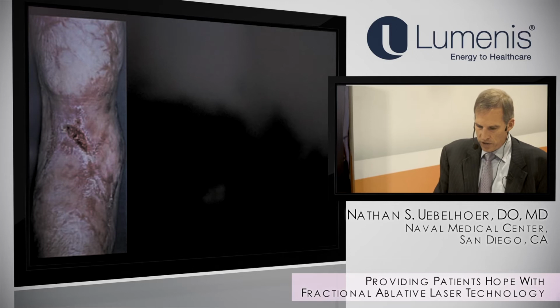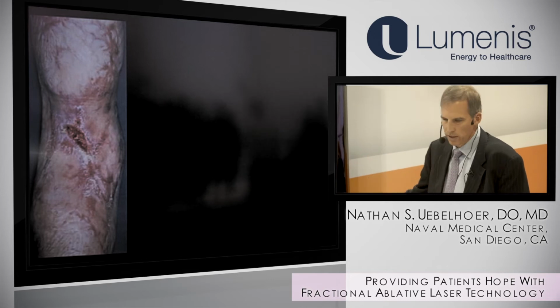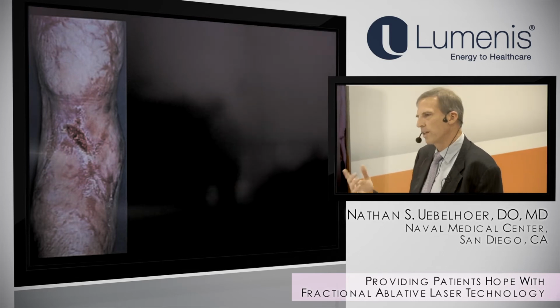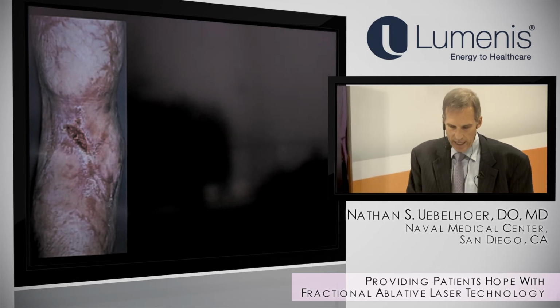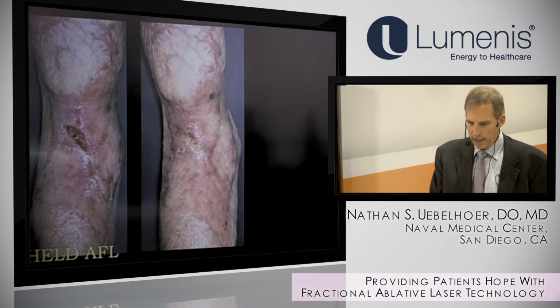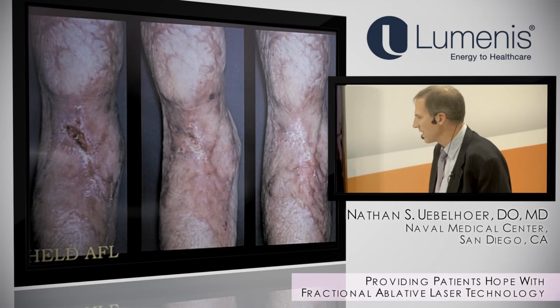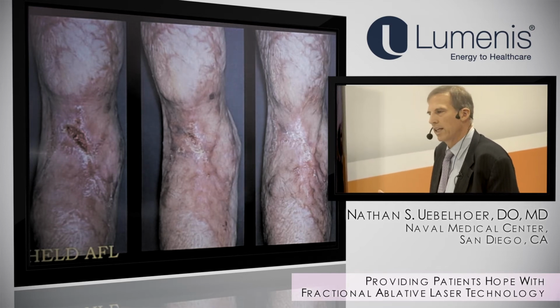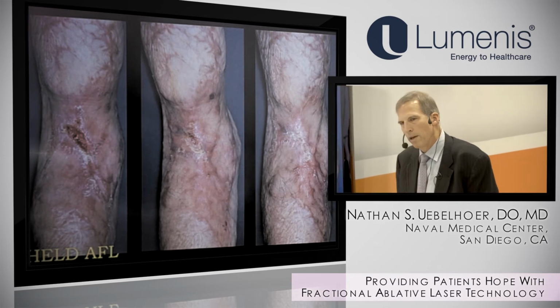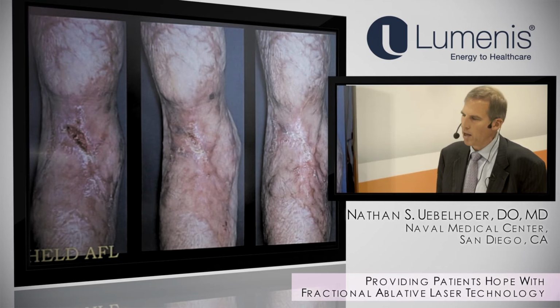So we started trying to treat other ulcers like this one. This is a classic ulcer right over the area of most tension in this gentleman who had many operations, Z-plasties, to try and improve this. We lased him with this high-energy, low-density ablative fractional laser. In a couple of weeks, he looked like this. After 3 or 4 treatments, he was at this point, which was a dramatic difference. Our wound care clinic was very surprised. It was initially thought to be just coincidental, but since then we've treated many scars and ulcers like this, and they respond really well.